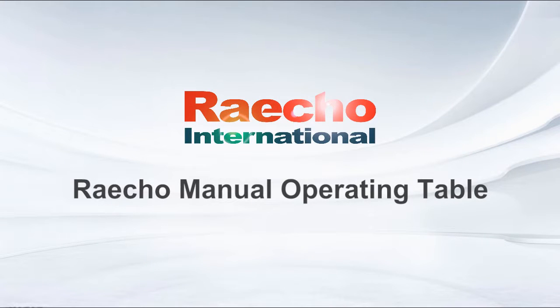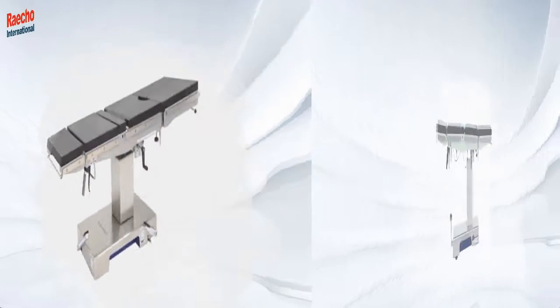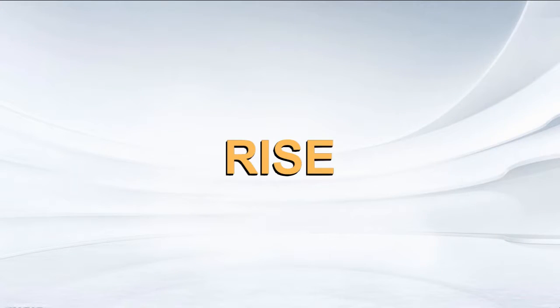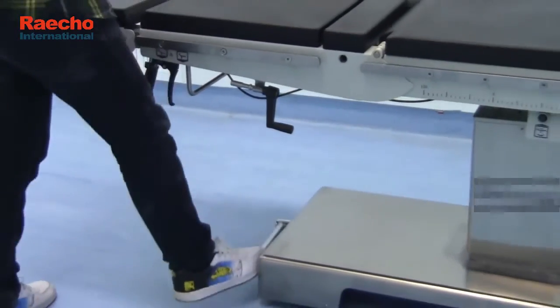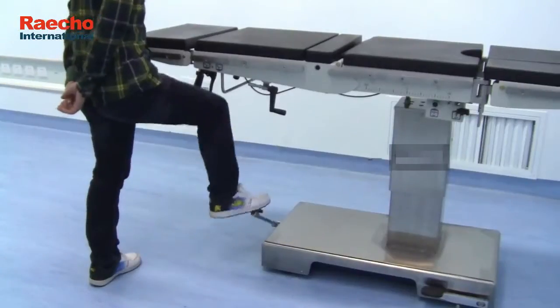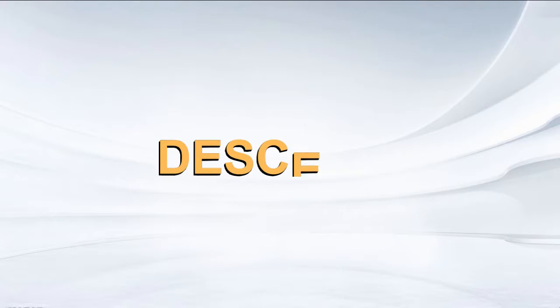RECO Manual Operating Table. Rise. Descend.